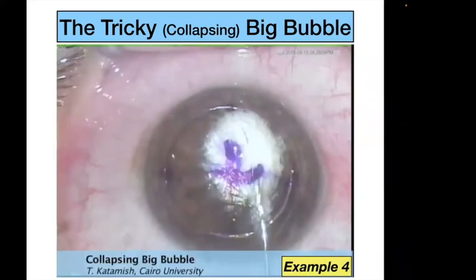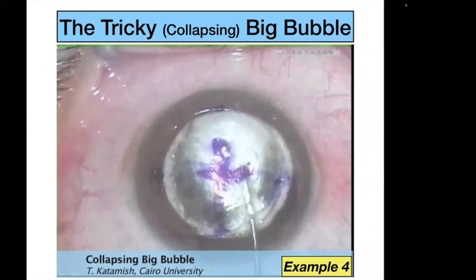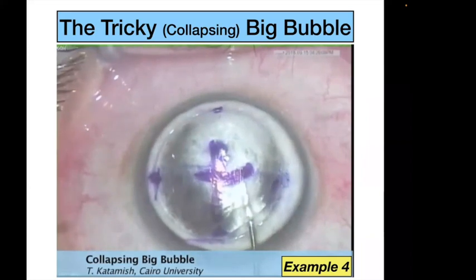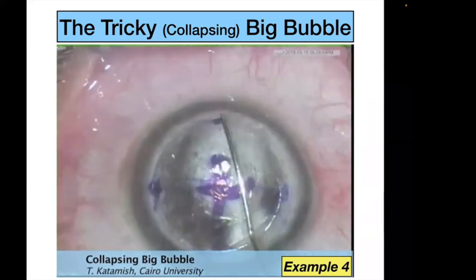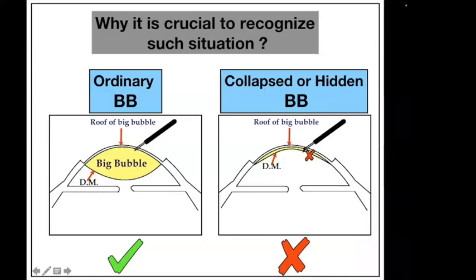Another example, injecting, and when you are going out, watch carefully, the air will come out. And this is the source of leakage. You see this tract is a source of leakage. Okay, why it is crucial to recognize such situation? Because if you have a collapsed big bubble and you don't recognize it, and you go to open the big bubble roof, you will make injury to Descemet's membrane because the roof is very close to the floor.